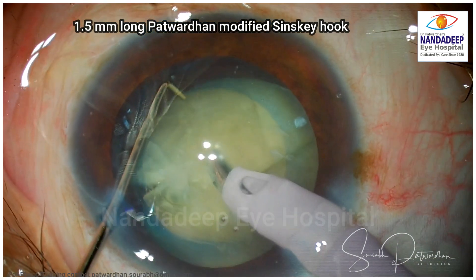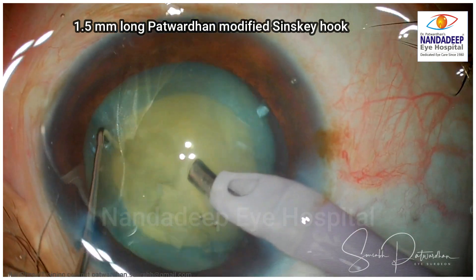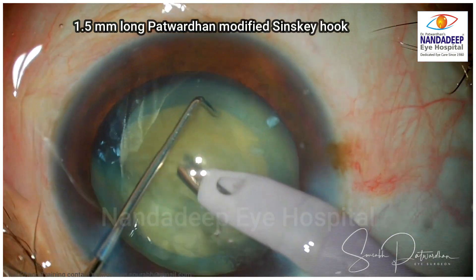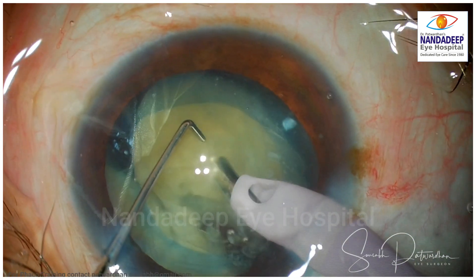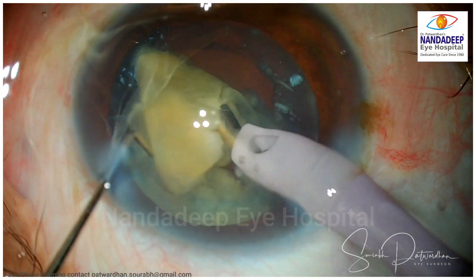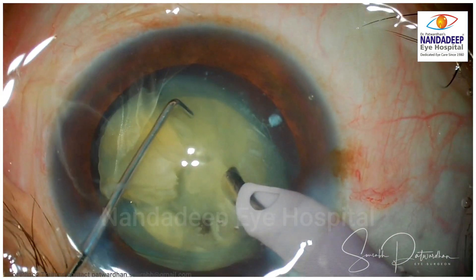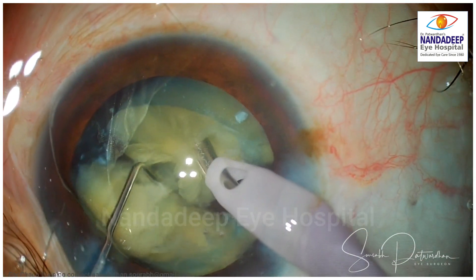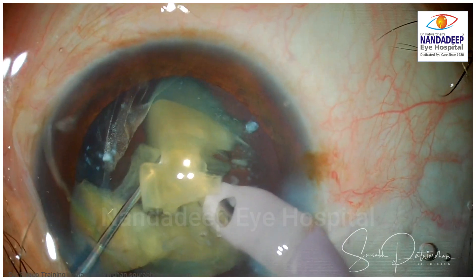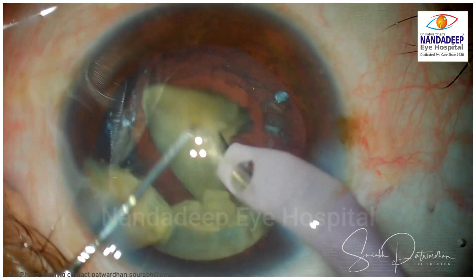I am using a 1.5 mm long Patwardhan modified Szynski hook. You can see the tip of it is blunt — not like a ball, but blunt — so I will not be damaging the posterior capsule when I am doing the horizontal chops. I use exclusively these horizontal chops for such cases where vertical chops are difficult. With horizontal chop, as you go around the equator and start crushing the nucleus between the phaco tip and the chopper — the 1.5 mm Szynski hook — you can get a complete division of nuclear pieces. A vertical chop is a bit difficult to do in these cases.